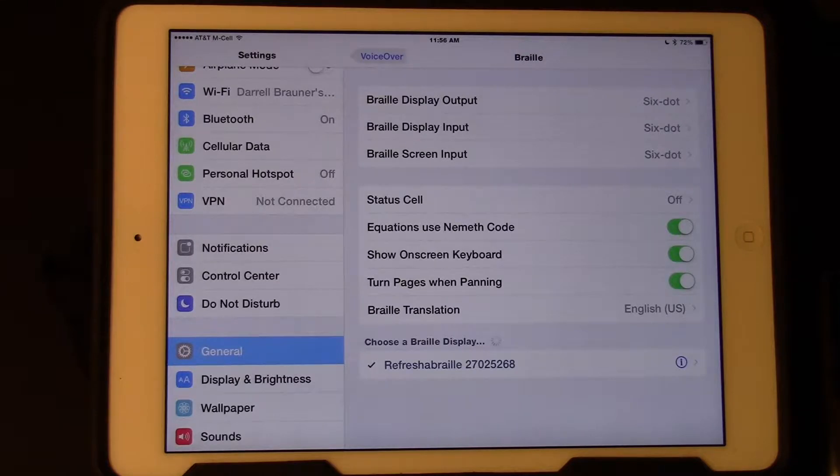Previously, you had to turn on VoiceOver in order to pair the refreshable braille display. If VoiceOver is on, remember the gestures change. You tap on 1, hear VoiceOver say "1," and double tap. Tap on 2, hear VoiceOver say "2," and double tap. Every APH18 refreshable braille display has the PIN number 1-2-3-4, then hit Done.